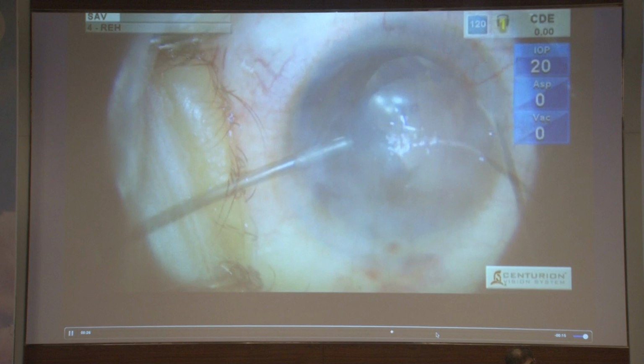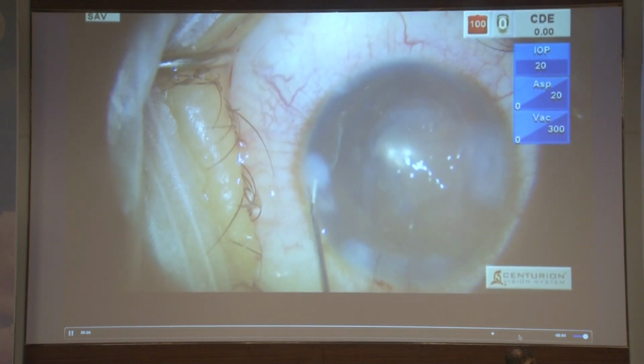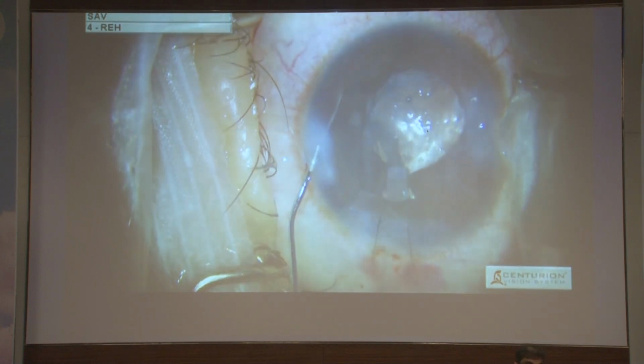In the end, always make sure that you have no vitreous disturbance, which we felt, and as you can see, the cornea did have stromal edema pre-existing. But look at this post-operatively at 1 year. The eye is extremely quiet, the optic is way behind, and the pupil is also doing quite well. So there are no cells on the IOL, there are no pits, no iris pigments, and so on and so forth.